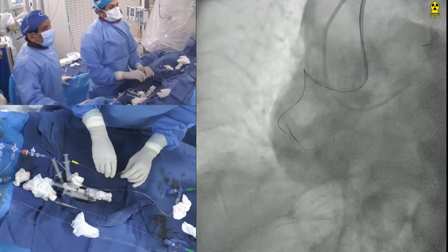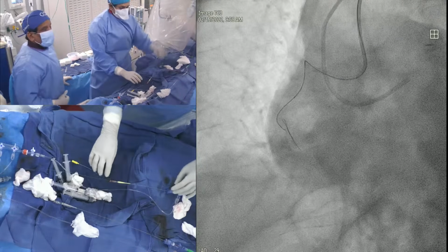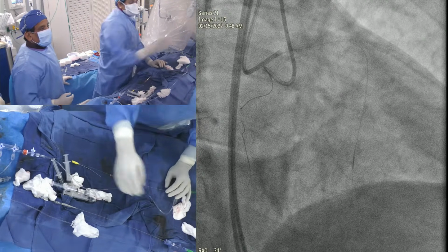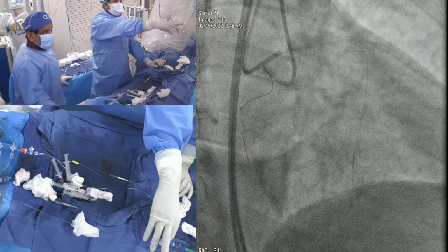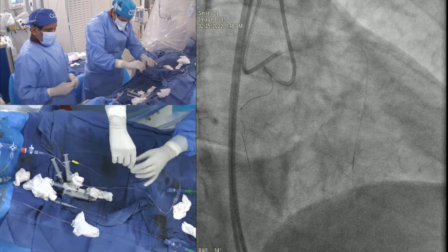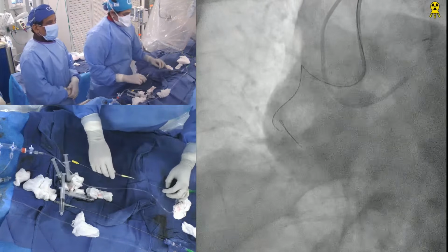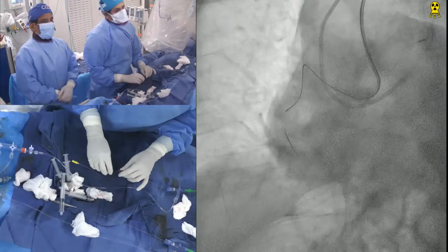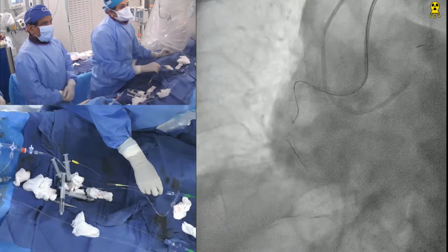Aggressive at this stage. No, but how? Because you're not in the septal. You know, it's just in the mid part of the septal. If you go there, you cannot do wire exchange here. Yep. That would have been the plan. If we had the microcatheter into the PDA, I would change it to some stiffer wire. But we cannot do that. Yeah, so I think one of the big limitations here is our microcatheter didn't go further. With wire bent, guides are coming out. Everything is coming out.